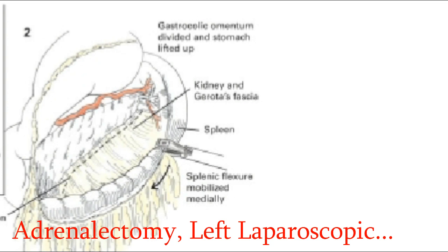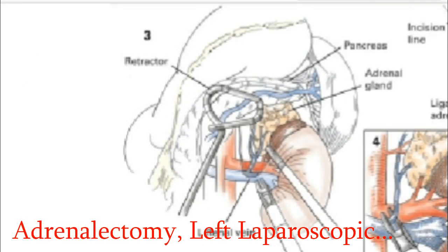It is not necessary to mobilize the spleen. The lesser sac is entered and the retroperitoneal structures are identified. The lateral adrenal is exposed along the posterior surface. The anterior peritoneum is incised to expose the upper portion of the adrenal. The dissection is continued under the anterior peritoneum while the assistant holds the pancreas anteriorly. This dissection should be continued as far superiorly as possible.